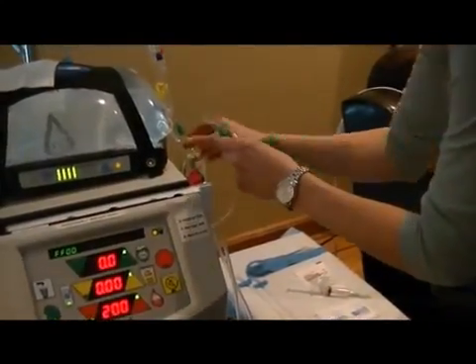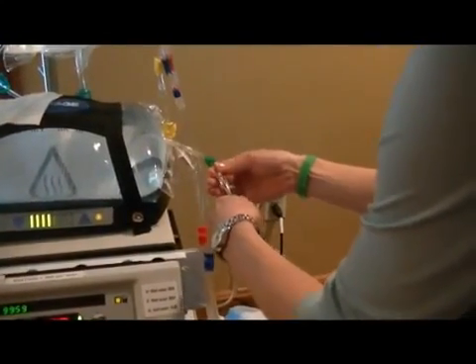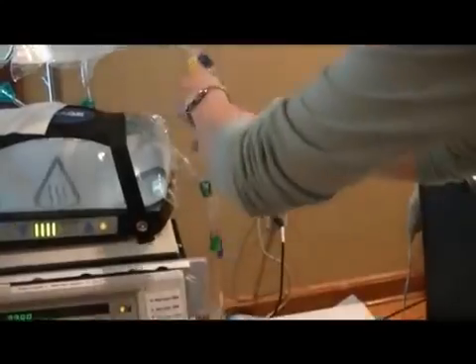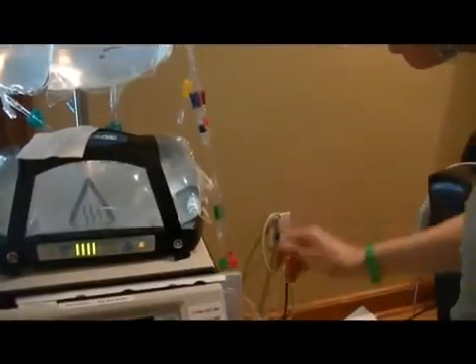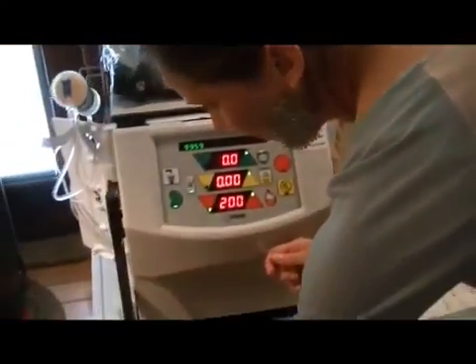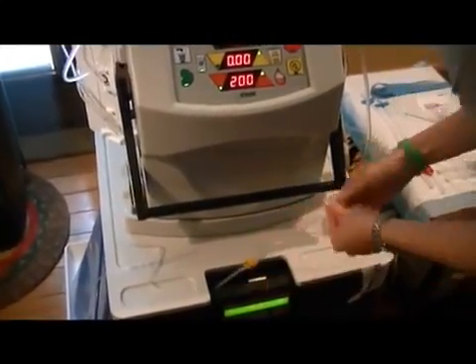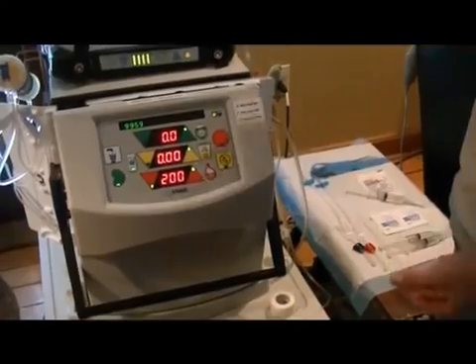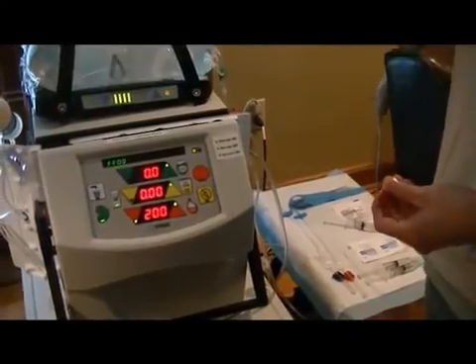Then you hook the green line to the connector here, like I said earlier, so this is how the dialysate gets in the lines. So you hook this up and you open those clamps. Then the yellow line is always your waste line. So you hook it to the waste line here that's in the machine, and we have a line that goes over here behind and goes down to the basement to a drain. So the waste that we actually take off of him, which is like your urine, like the machine does for him, goes down through the drain in the basement.